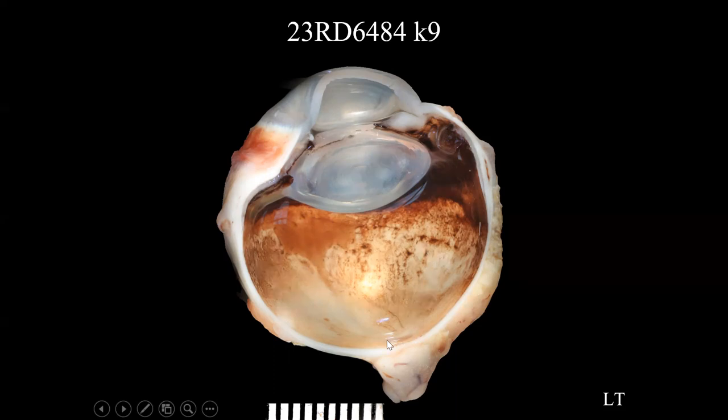You can see it is a husky, a blue-eyed dog. You can see how the back of the eye is poorly pigmented. And here is the white fluffy mass in the iris they described. You can see the other iris leaflet here, the iris pigmented epithelium, and kind of a white discoloration of the iris. We'll focus on that, but also I'll look around a little bit here. Keep that in mind. Don't worry about that too much for now.